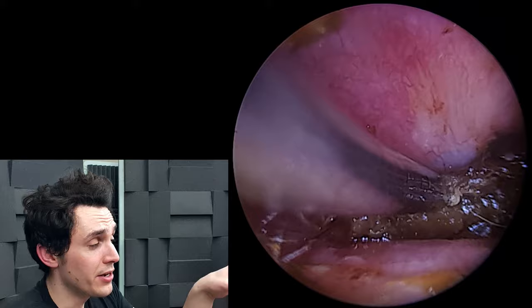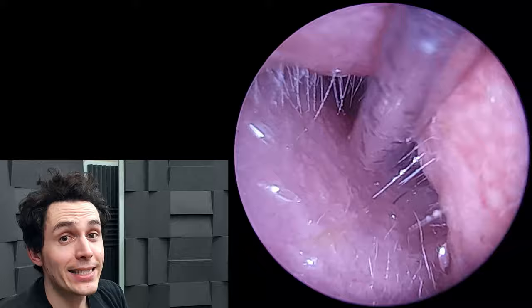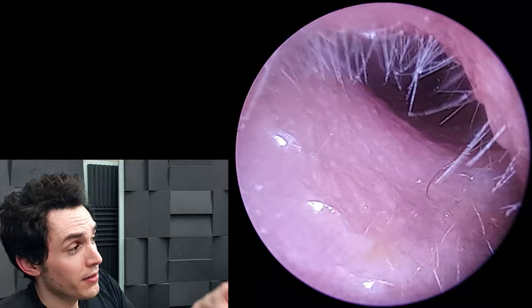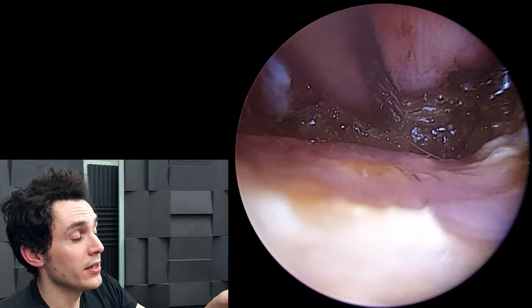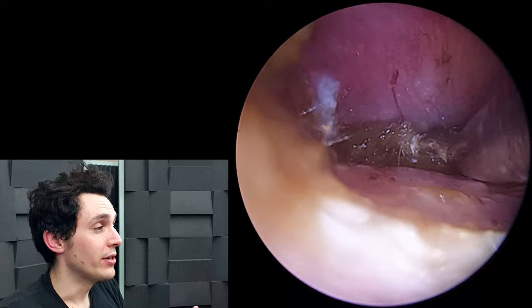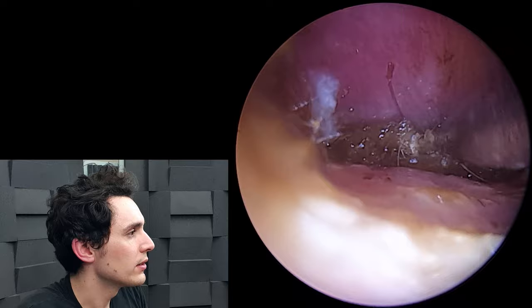The fine end gauge has a slight bend in it, which I sometimes use just to give me better access. Thankfully, the Otomize not only worked to reduce the inflammation and resolve the infection, but it also loosened this huge chunk of wax right up so I could actually leverage it out of this recess.